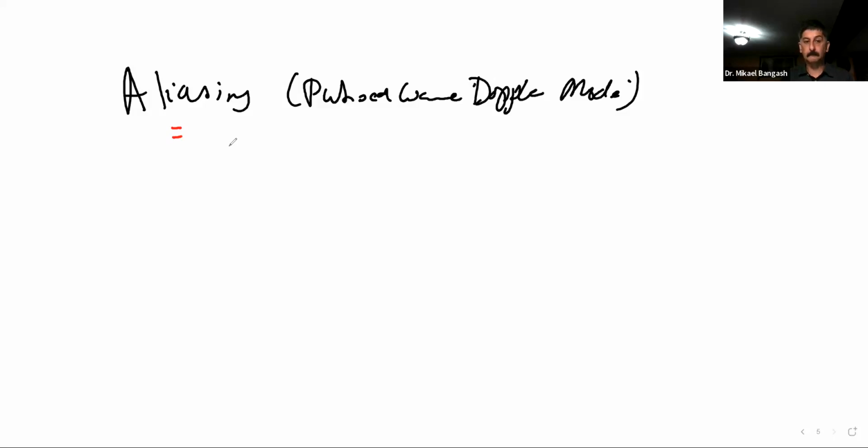So in pulsed wave Doppler, what we referred to at that point was that we had a sampling rate, which we can now call your Nyquist limit.